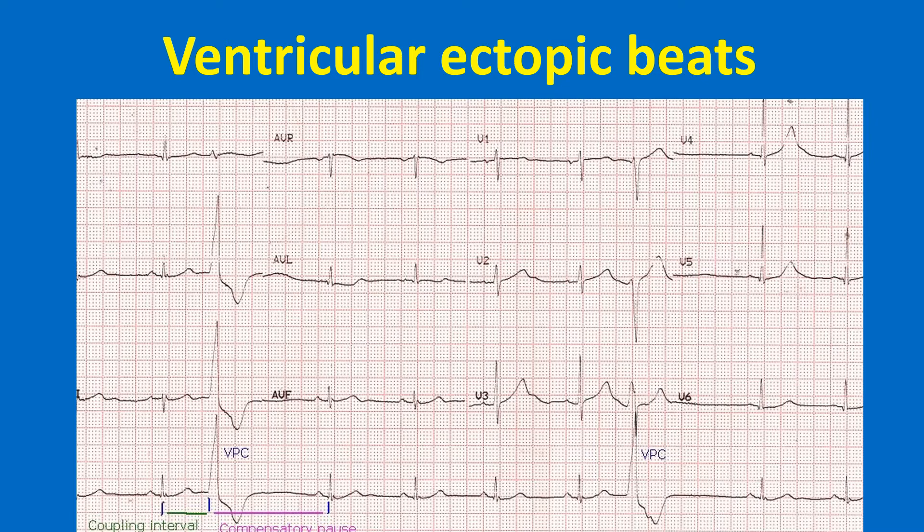There are two wide QRS complexes seen in the lead II rhythm strip. Both are of similar morphology, hence they are called monomorphic VPC. Monomorphic VPCs are usually unifocal and have the same coupling interval. Coupling interval is the interval between the onset of the previous normal QRS complex and the ectopic QRS complex. Ventricular ectopic is identified by the absence of a preceding P wave, bizarre wide QRS, and secondary ST-T changes.